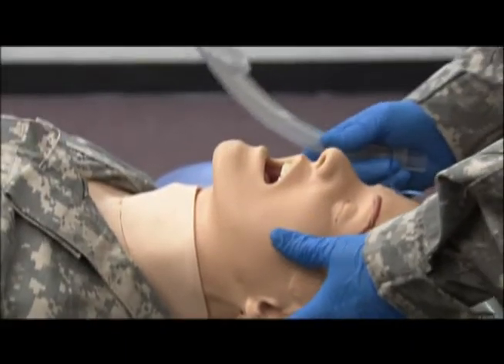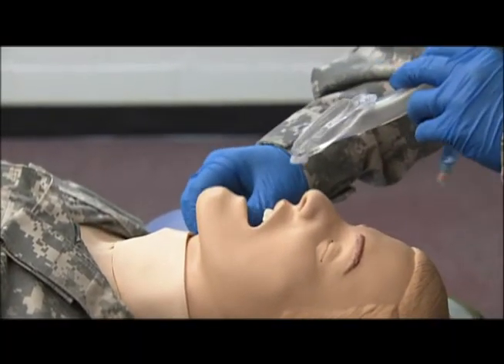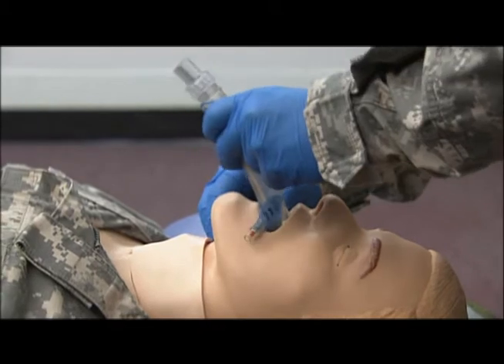With the head in a neutral inline position, I want to grasp the bottom of the jaw, opening the mouth and insert the LMA.